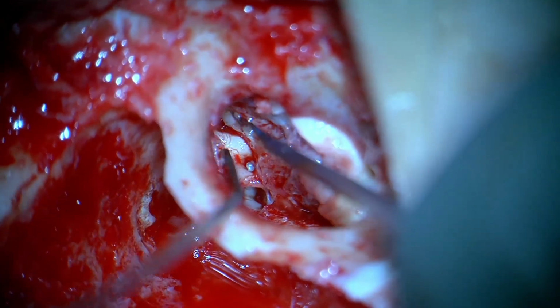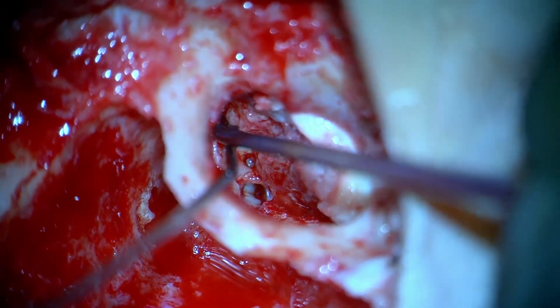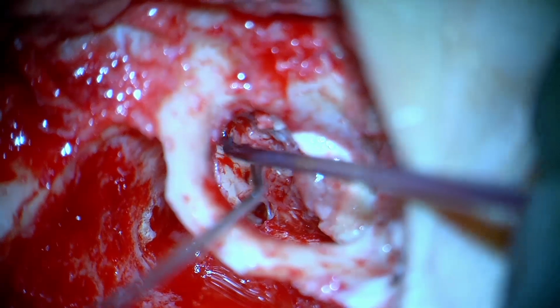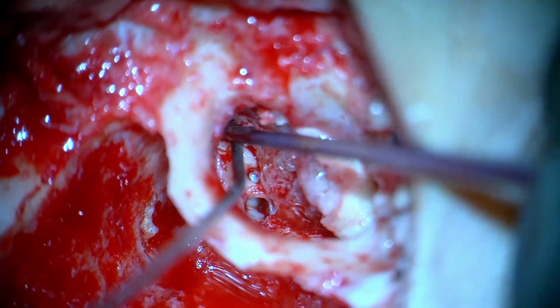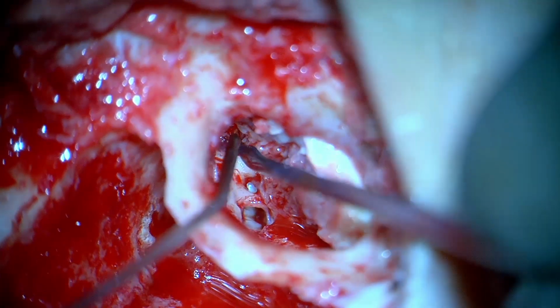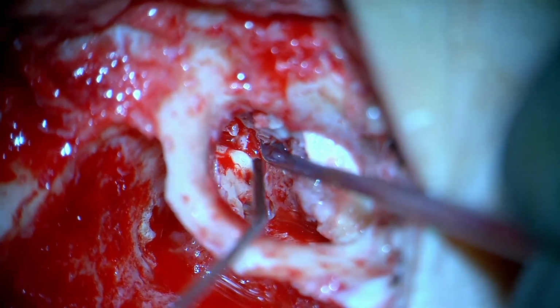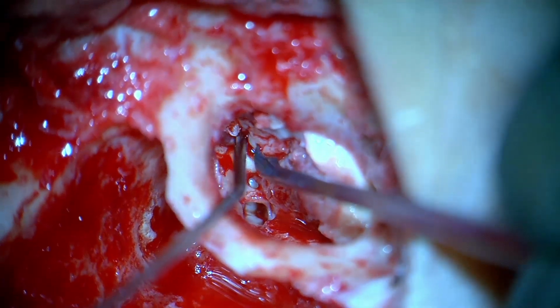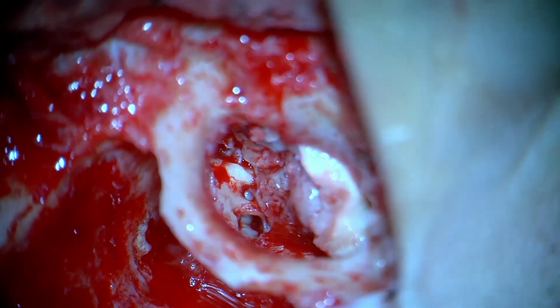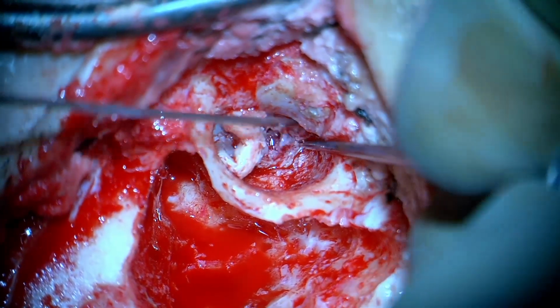And once again, one has to be very cautious in lifting this mucosa and not exert too much pressure, because then there's a risk of stapes subluxation, given the fact that the IS joint could be expected to be intact in these patients. So clearing a disease from an intact IS joint is obviously very jeopardous. One can also see the anterior malleal ligament there from which the diseased mucosa has been removed.